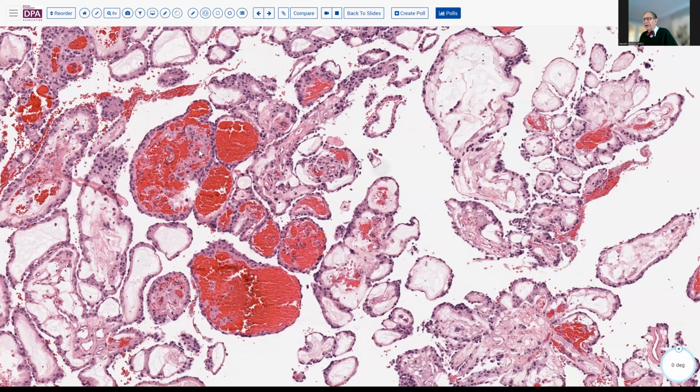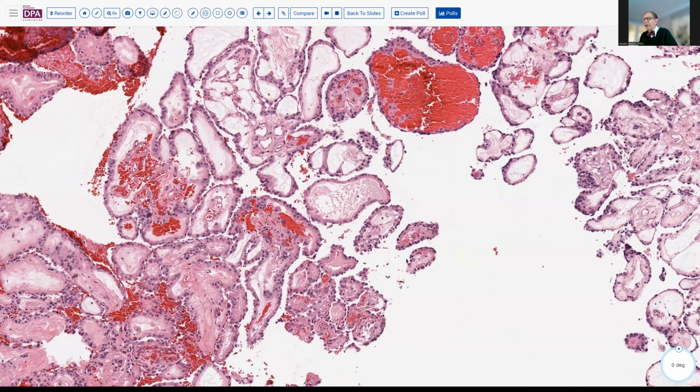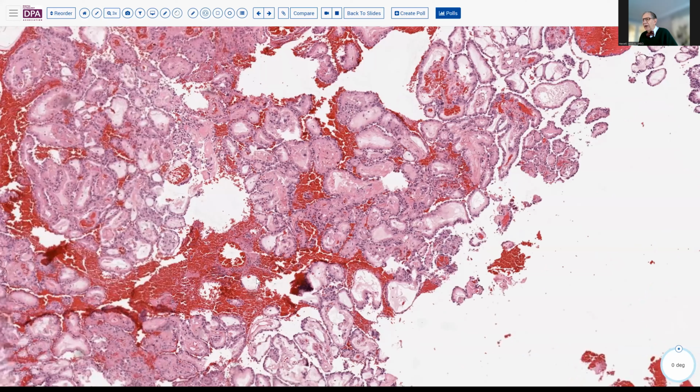It's certainly a neuroepithelial lesion. Originally, or earlier on, this was classified as WHO grade 1, but has recently been revised to indicate that these are more of a grade 2 tumor. I'm not familiar with all of the ins and outs of those decisions and so forth, but just by virtue of the histology, that's the grading that is assigned to this lesion.